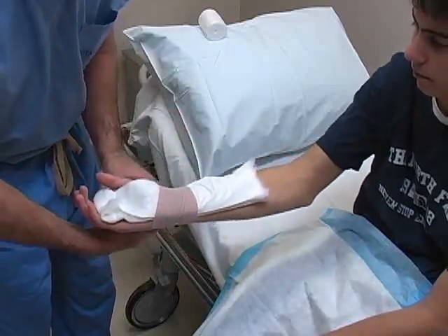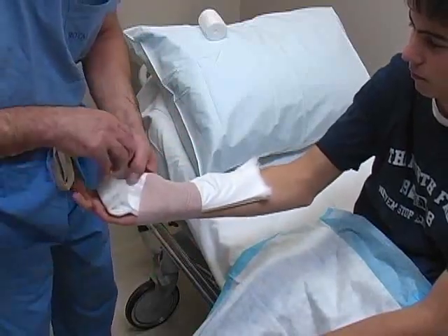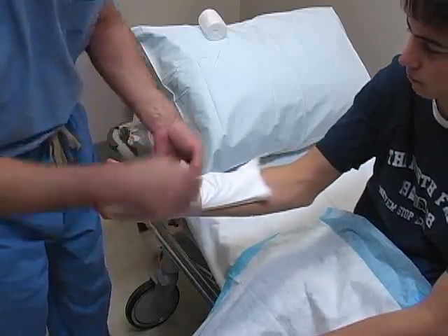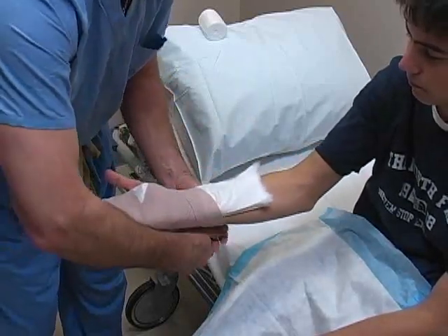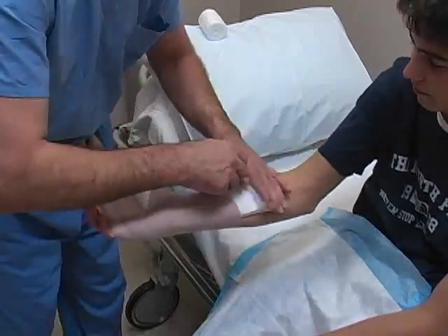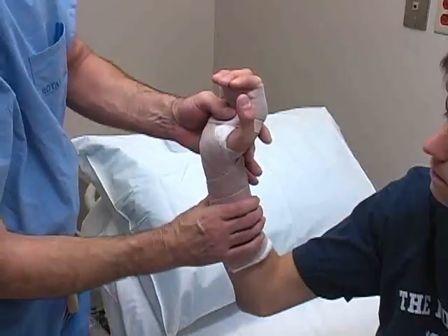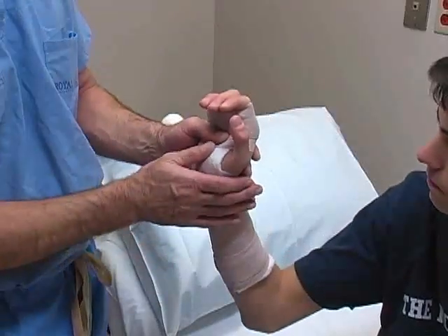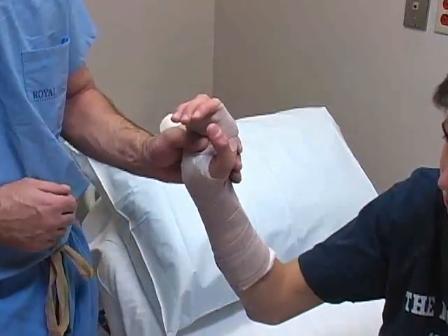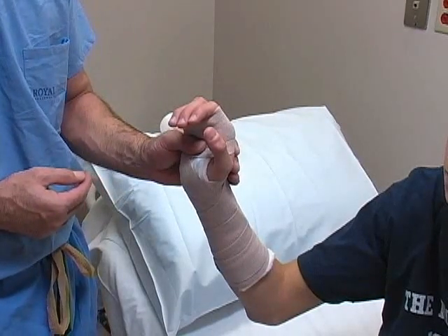Begin to roll an elastic bandage around the splint. In general, wrapping should proceed in a distal to proximal direction. However, it may be necessary to begin toward the center of the splint to secure it if assistance is not available. Overlap each wrap by 50% and apply a modest degree of tension to the roll as you progress. Once the splint has been applied, gently shape and mold it to the extremity using the palm of your hand — this must be done before the plaster has set, which usually occurs in about 10 minutes.